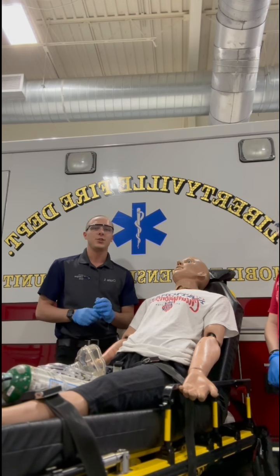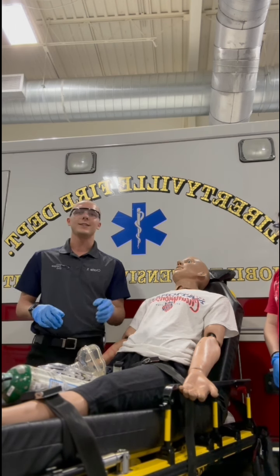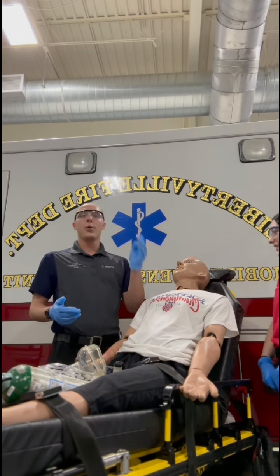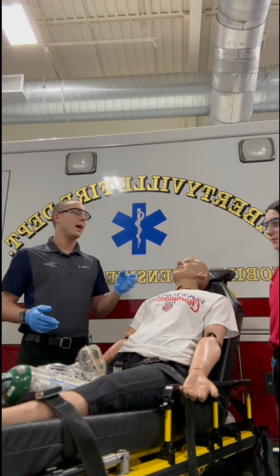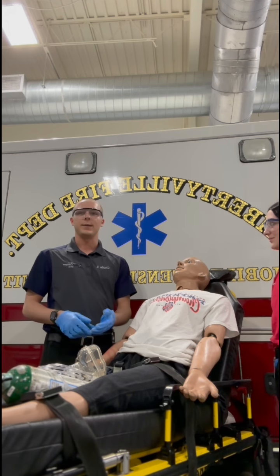Some contraindications when we're not going to use CPAP, the biggest one is going to be that systolic less than 90, as well as if the patient isn't even aware to maintain their own airway. Going along with maintaining their own airway, if there's any secretions in the airway, also contraindicated. If there's a big trauma and there's any facial trauma to the patient, CPAP is also contraindicated.